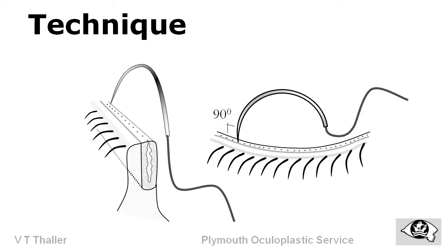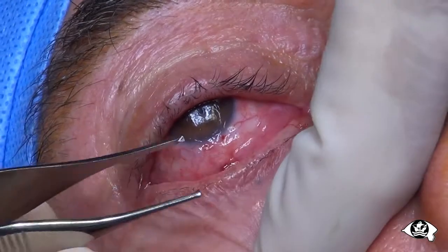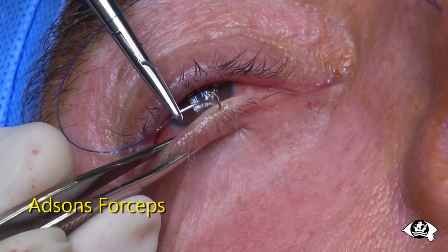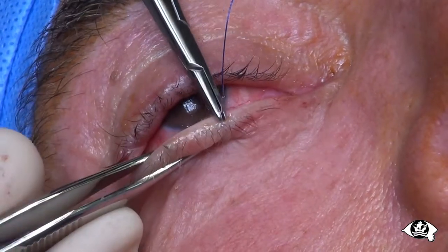The strength of a traction suture is proportional to the length of the tarsal plate bite. Suture placement is facilitated by holding the lid flat. This can be difficult with standard forceps such as Adson's, as seen here.